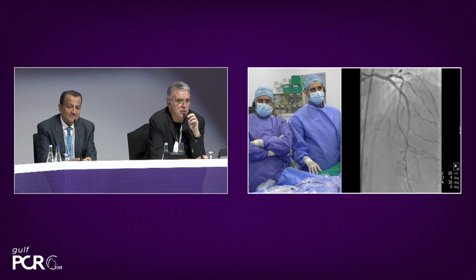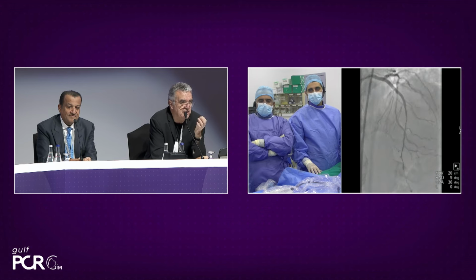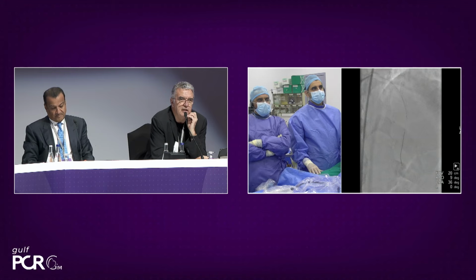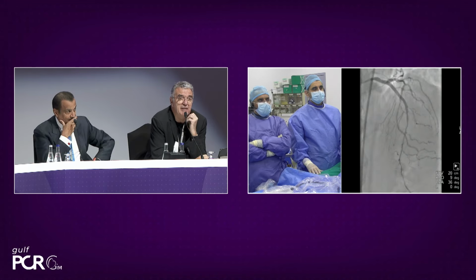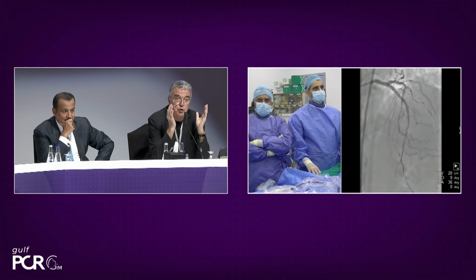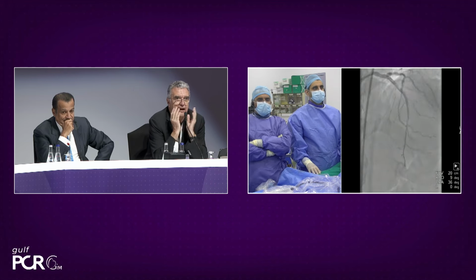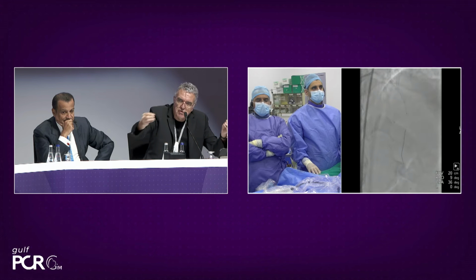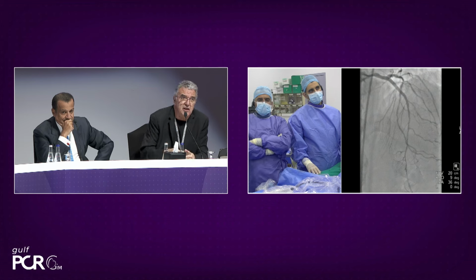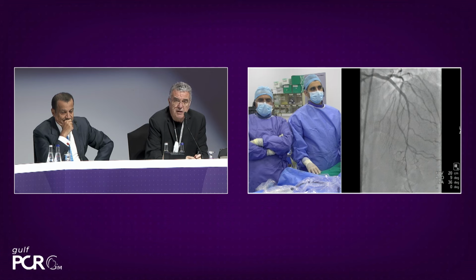It's really difficult. When you selected this case, we discussed together during the different calls for the preparation of this case, and we knew from the beginning that it would be a really difficult case. But that's the reason why we selected it, because this was the topic of this session: how to treat this long calcified lesion and the very diffuse disease on the LAD. Definitely there is no possibility for bypass intervention.